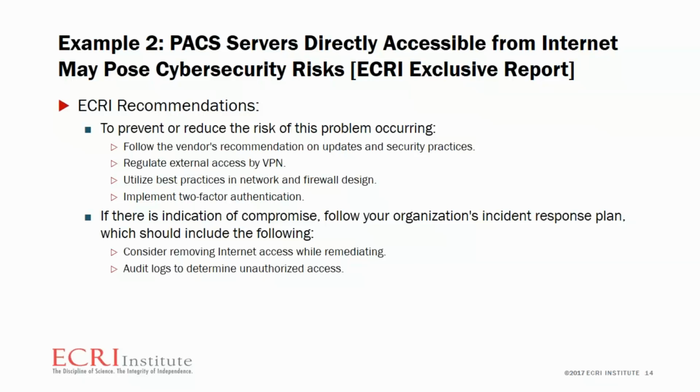We recommended hospitals move forward to prevent this from occurring, regardless of which vendor PACS system you were looking at, by following vendor recommendations and updates the best you can, while recognizing that this is not always practical. However, if merited, you should definitely move forward and update systems and follow the vendor security practices as outlined.